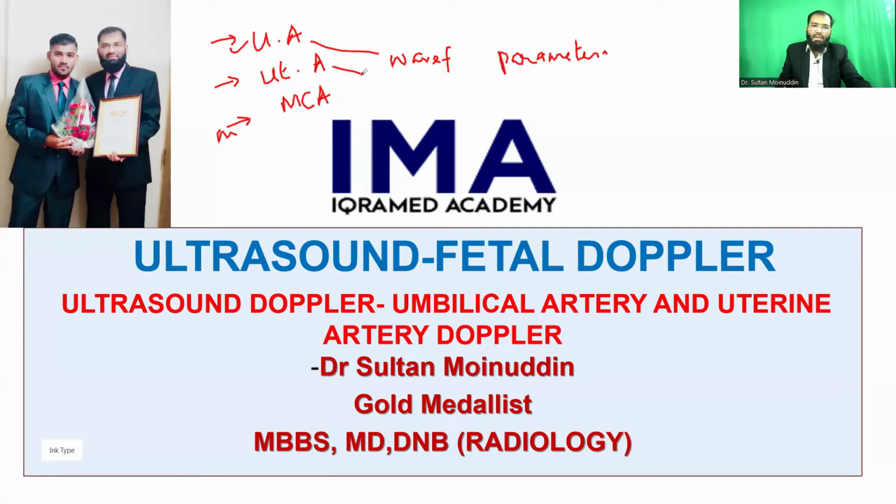Similarly, when you look at the uterine artery, you see the waveform and you see the various parameters. Similarly, when it comes to MCA, you see the waveform, you see the PSV, you see various parameters. Now, there are actually three important aspects when a vessel is to be examined. So suppose this is a vessel.